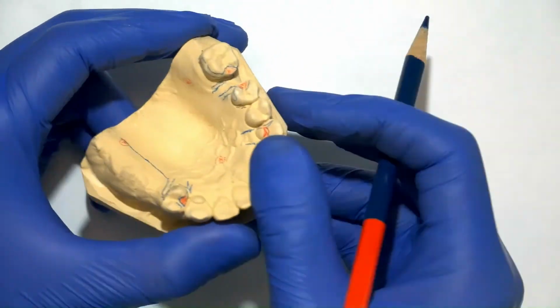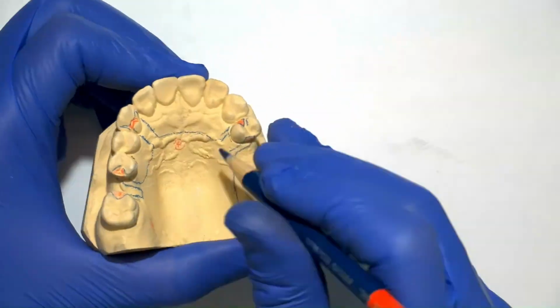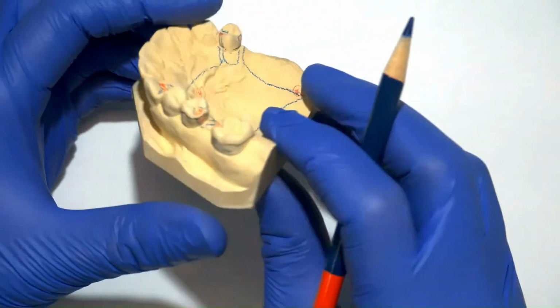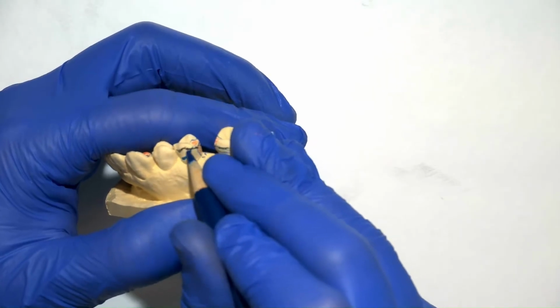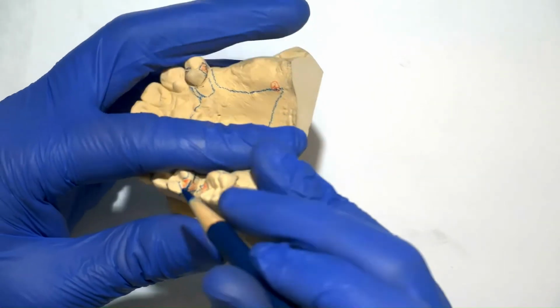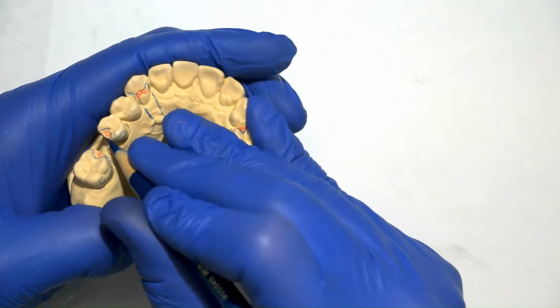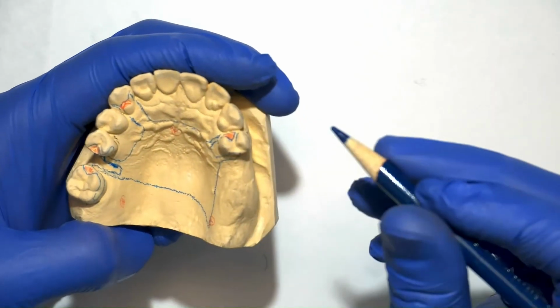Now we'll start connecting all the different edges of the minor connectors to start developing the shape of the major connector. Let's start finishing up the different clasps, starting with the wrought wire clasp, going from the retentive clasp point, going along the guide plate, and then down back where it will solder itself to the lattice.